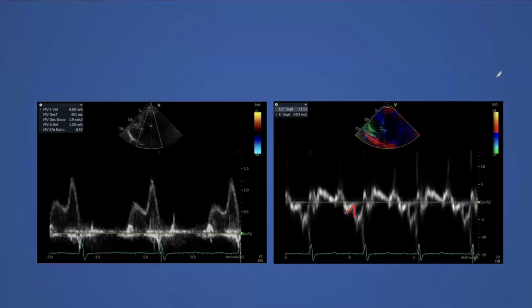It's easy if you've got a young, fit, healthy person. We usually don't care about it in those folks. It's in the others where we're trying to say, is there a structural abnormality which then might fit with the heart failure preserved ejection fraction syndrome, right? True. Yeah.